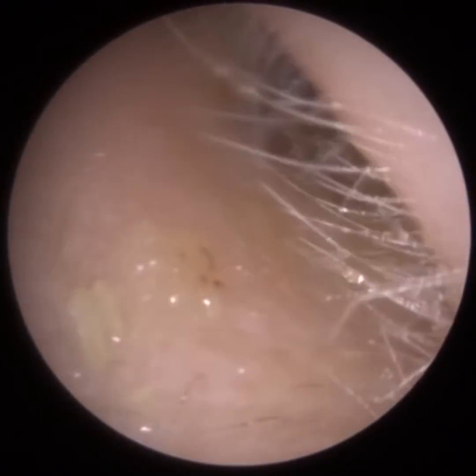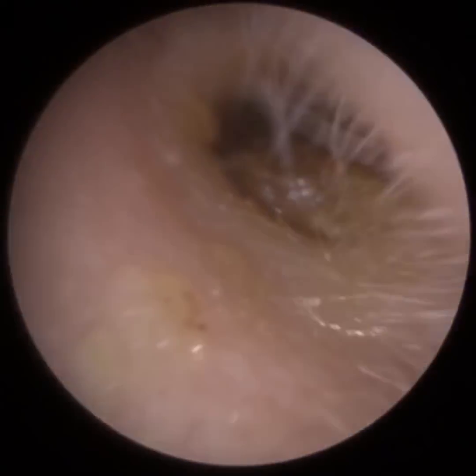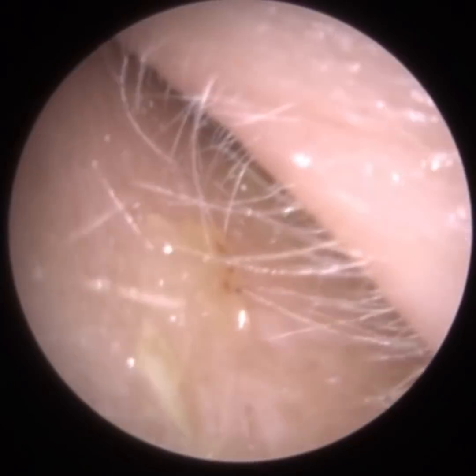So for a patient who attended with bilateral fully occluding earwax and also some fungal spores in the right ear. So this is the left ear that we're commencing with now. This procedure is a technical challenge and you can just see why now.